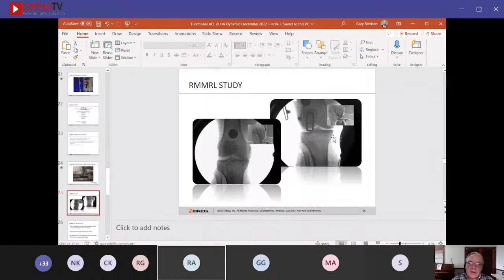In several of these studies, we not only track the heel strike, this is a heel strike image. We also look at the mid-stance images, and they produce the same results in mid-stance as they do at heel strike. We have a lot of this footage and data from over the years. This study was originally done with 12 patients and then extended over the years to more than 200 patients, all mostly the same results. This is the pull brace which you have used, right?